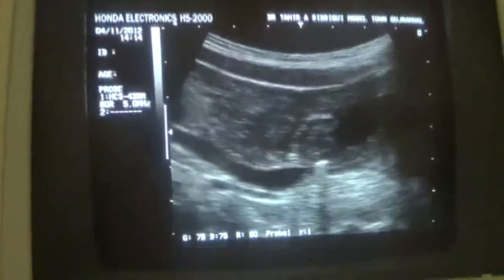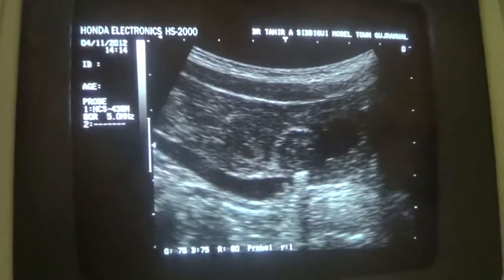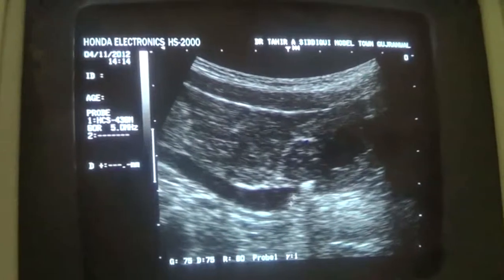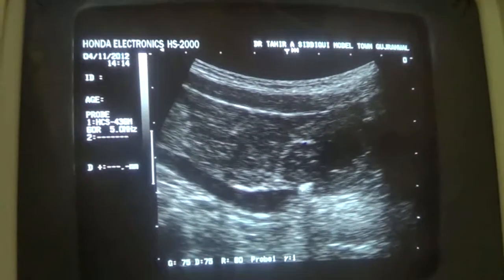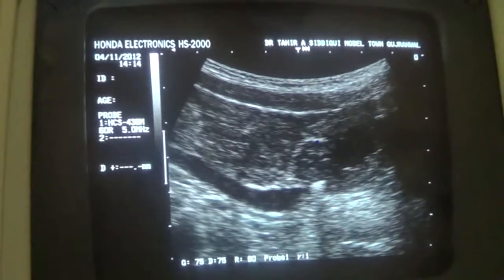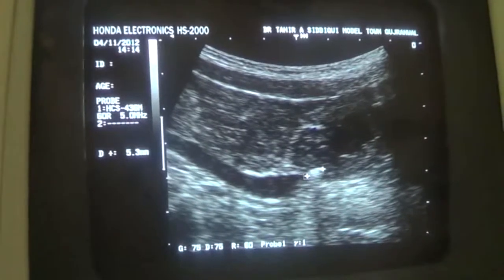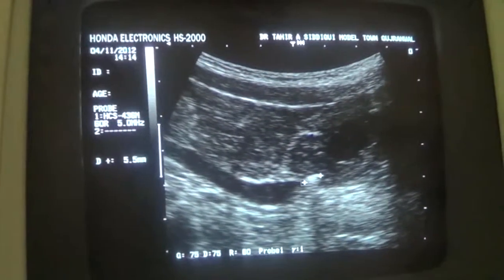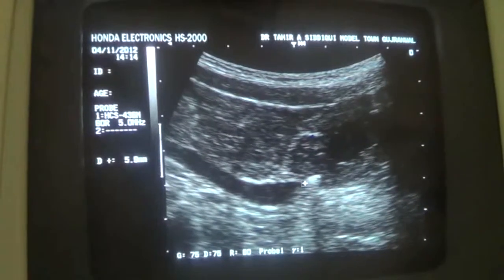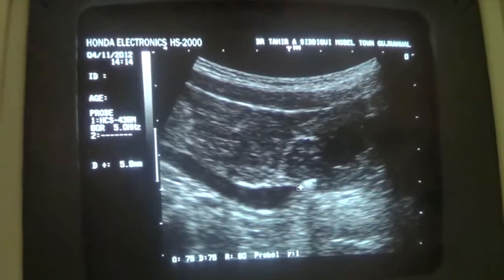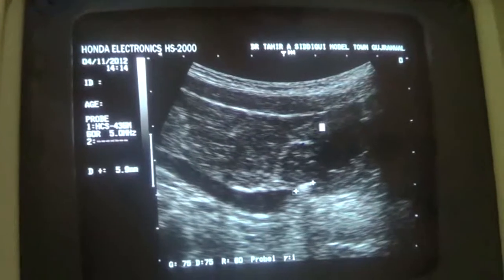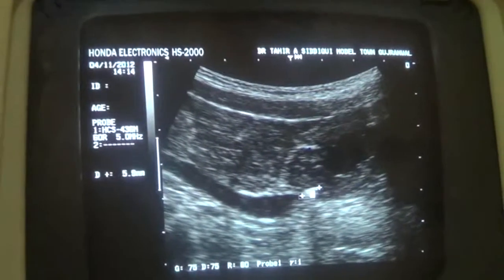Here we see the distal ureter is dilated. This is the distal ureter, and here a dense coarse echogenic area giving posterior shadowing is identified in the area from where it enters the urinary bladder. The calculus measures 5.9 mm. This is the lumen of the urinary bladder, this is the wall of the urinary bladder, and this is the calculus.